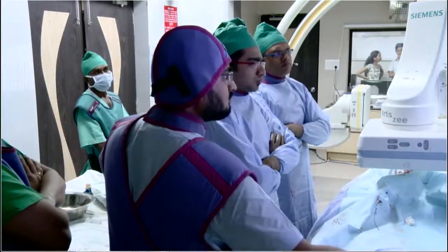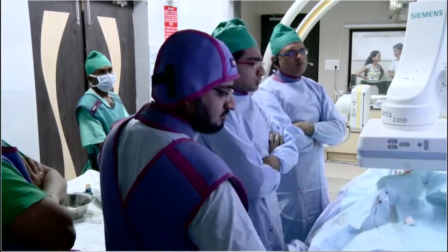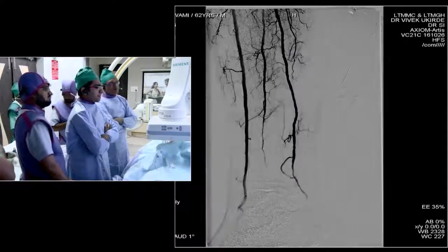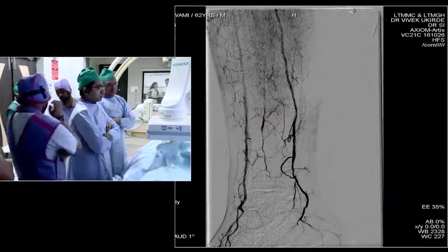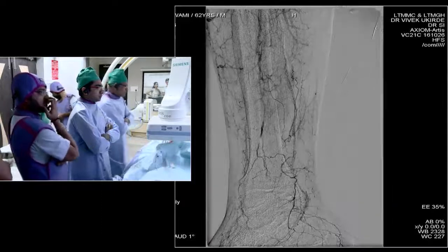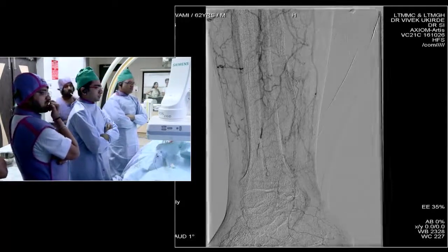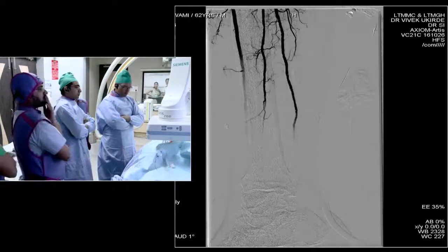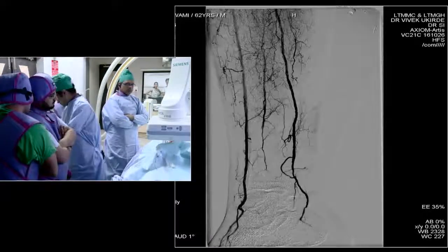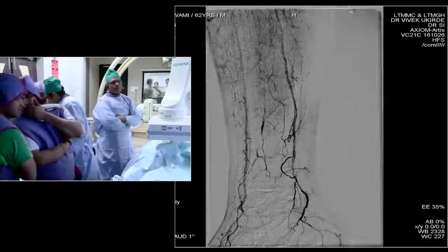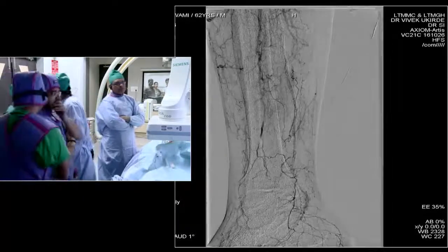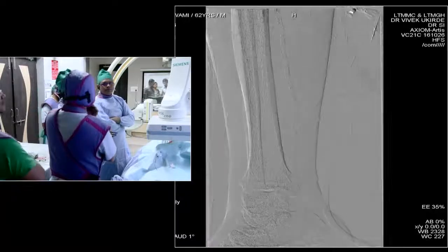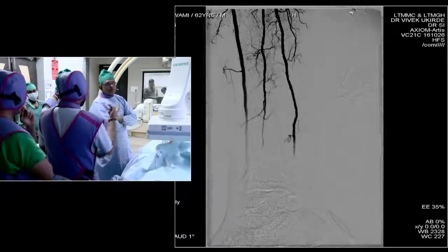In coronary, by six months the crystallinity of the scaffold is going away and it starts degrading. By one year you practically only see the markers and few struts. At two years with OCT follow-up, majority of the scaffold has been absorbed.